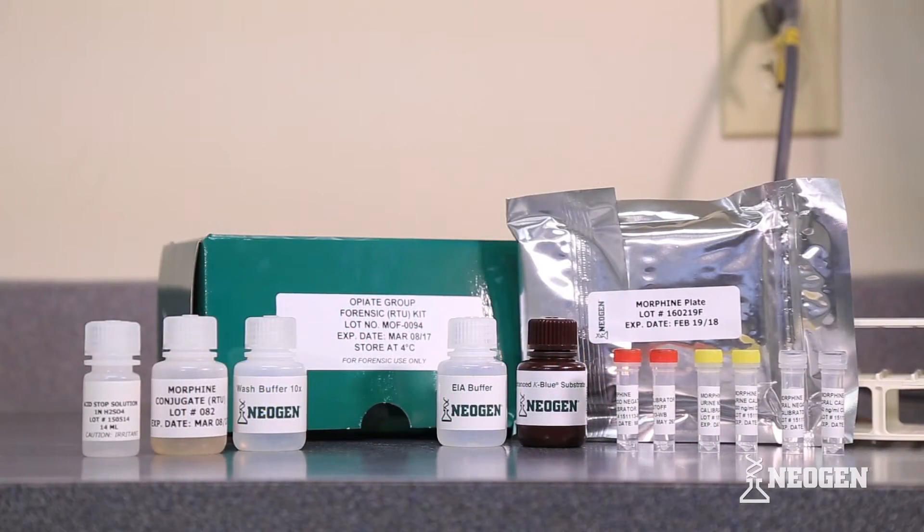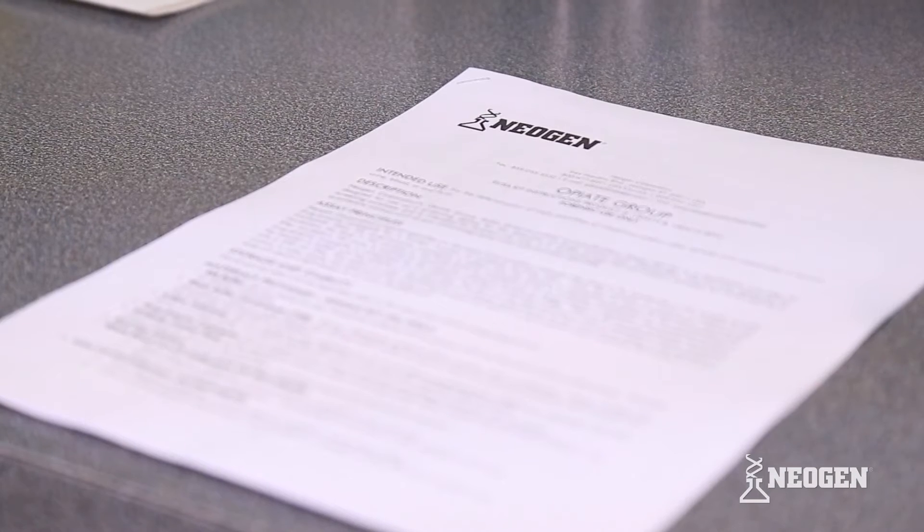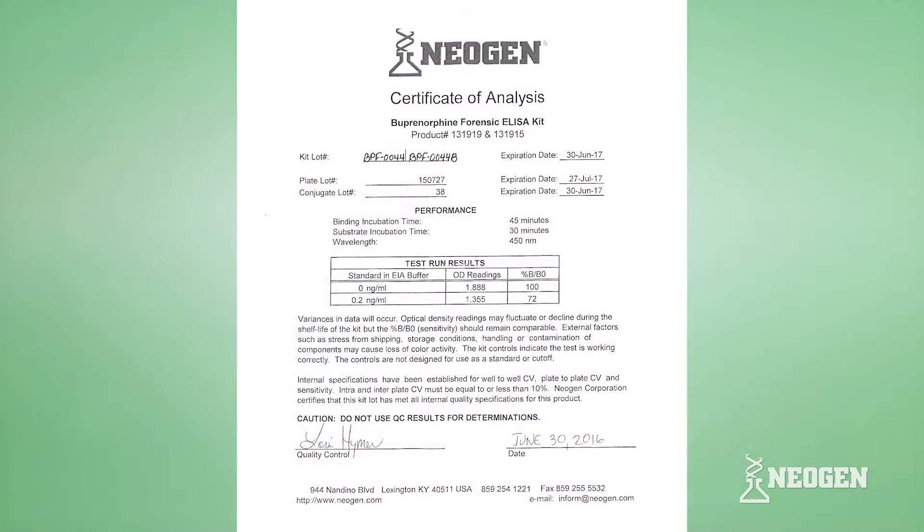Neogen Forensic RTU Kits include all of the reagents you will need to perform this assay, as well as a protocol outlining step-by-step instructions for the procedure. Also included is a Certificate of Analysis which includes important, lot-specific data like lot numbers, expiration dates, and typical data.